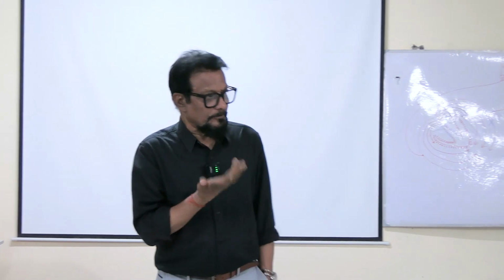Left side, left sternal border, fourth intercostal space. One is the right side, the other the left side. The position is the fourth intercostal space at the sternal border. Now, I did not tell about lead 3. I forgot to tell where it is.